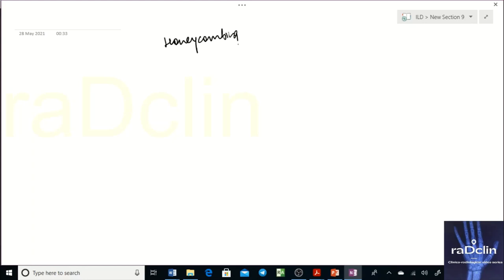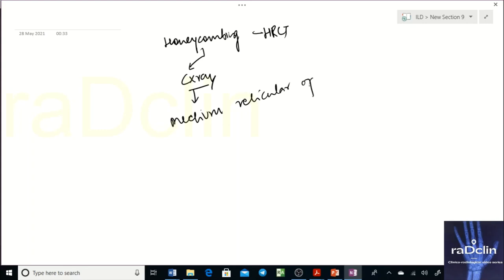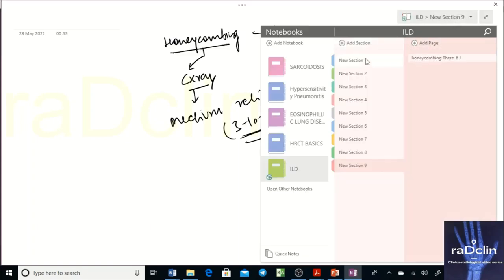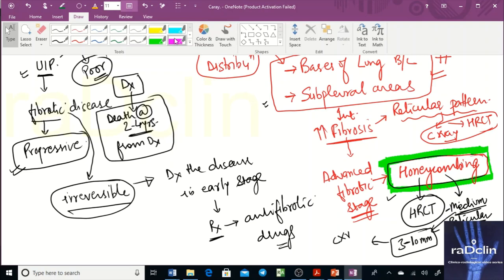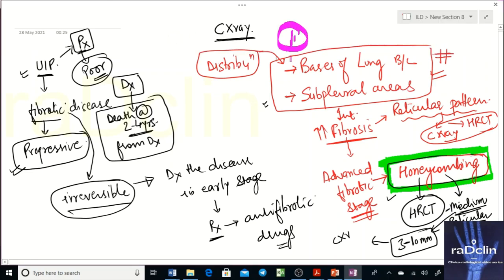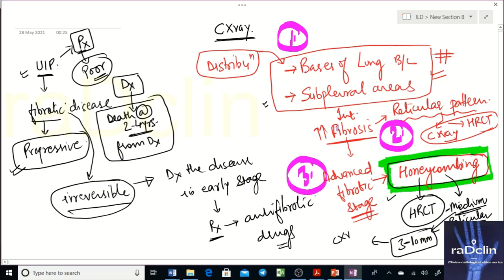Honeycombing correlates on chest X-ray with medium reticular opacities — air spaces of 3 to 10 mm. So the three key things to remember in UIP are: first, the distribution (subpleural and basal); second, the reticular pattern; and third, honeycombing.